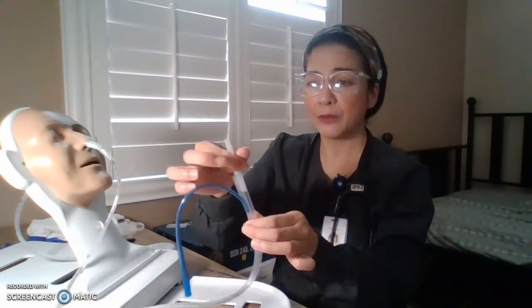Okay, and what I do not have with me here is only the suction canister and the suction tubing. If you're doing it in a home, you would probably see a portable suction. If it's a facility, you'll see it on the wall. Okay, so if you need to attach this to a suction, you would remove this and attach it to the suction, or if you're feeding, attach it to the feeding.